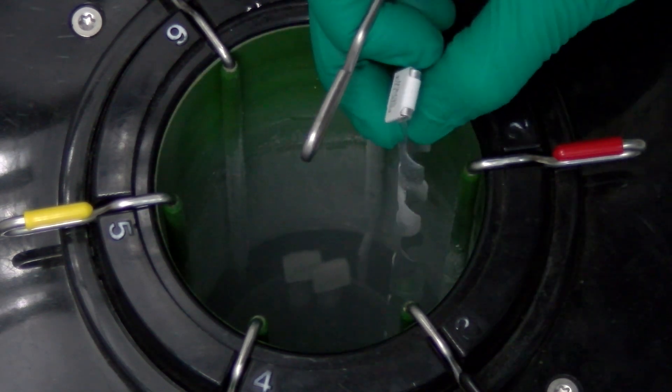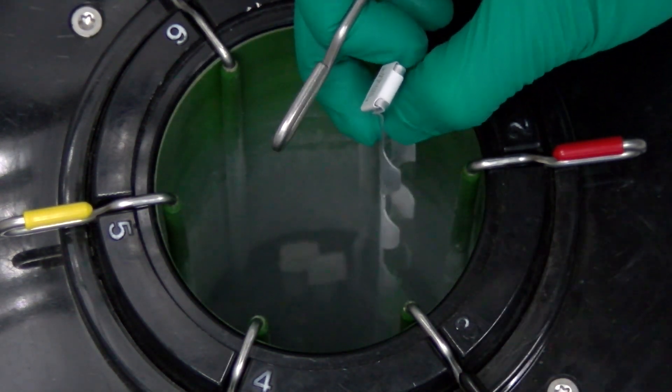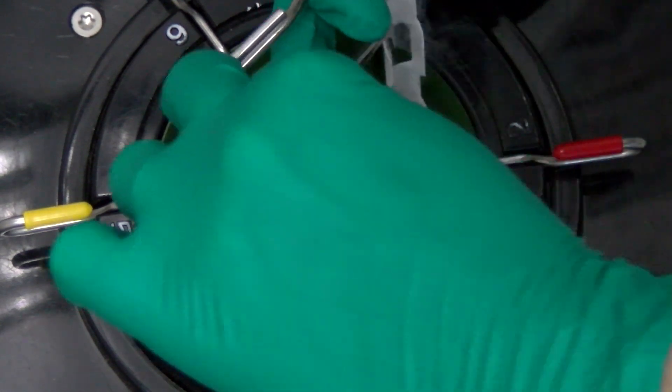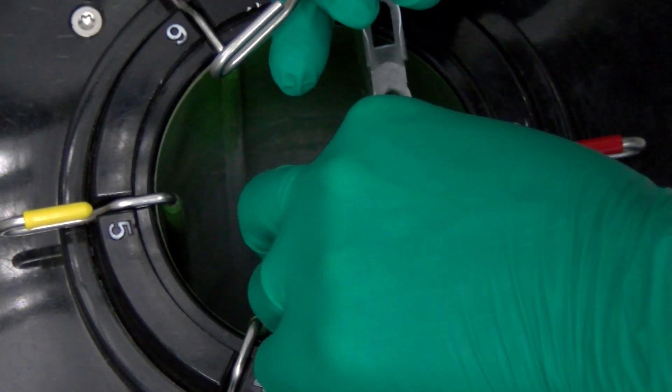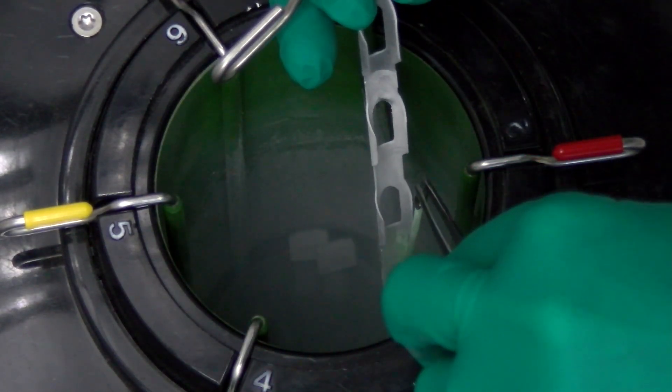Use tweezers to remove the semen straw. It will take some practice to become comfortable with this movement. Remember that your fingertips are a heat source and should not be used to grasp the semen straws.